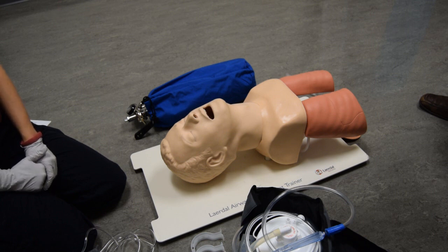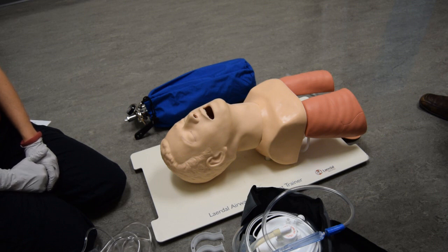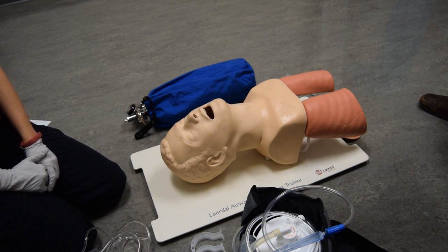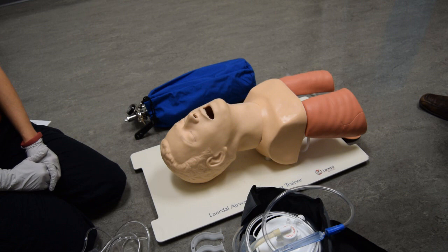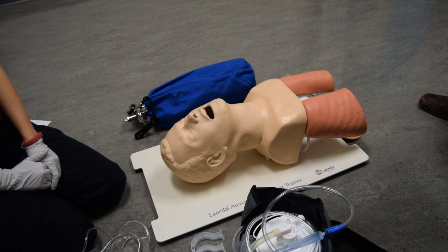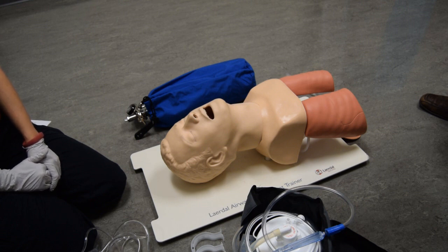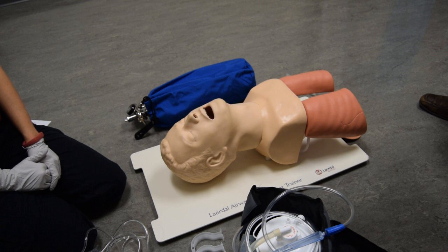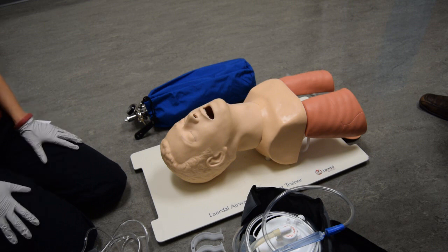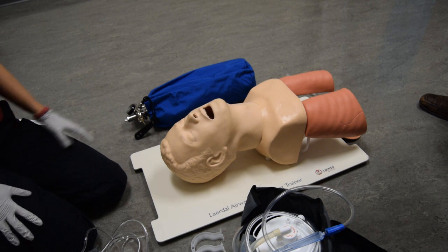I will serve as your trained assistant and will be interacting with you throughout this skill. I will correctly carry out your orders upon your direction. Do you have any questions? No. At this time, please take two minutes to check your equipment and prepare whatever you feel is necessary.